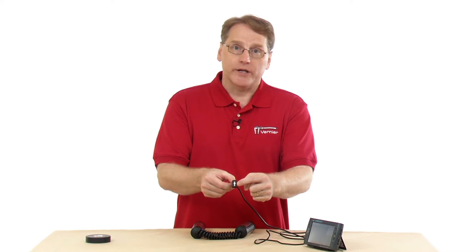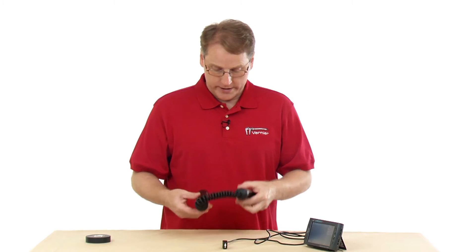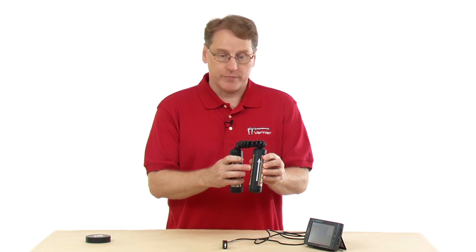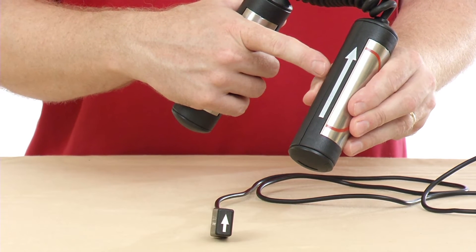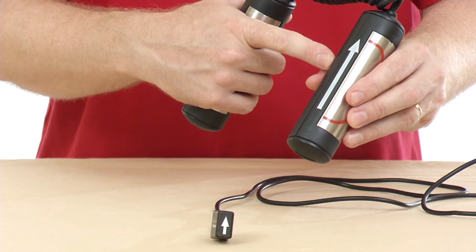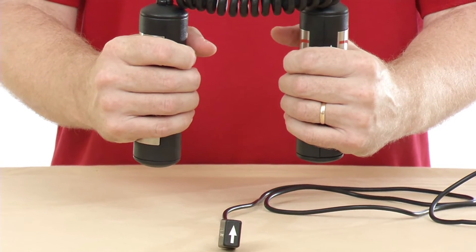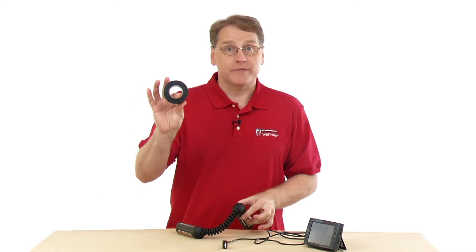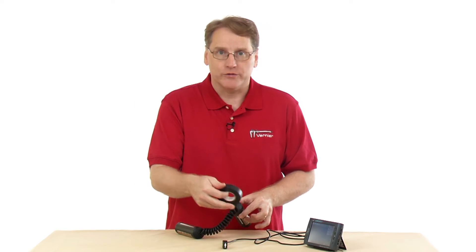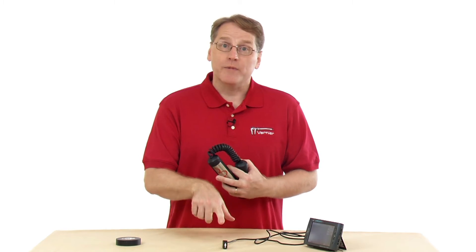A couple of issues to keep in mind. You'll notice there is an arrow on the receiver — we suggest you try to have this arrow in the same orientation as the arrow on the hand grip piece. By holding it in the same orientation, you're more likely to get good data. We also suggest that you hold the hand grip unit no more than about 80 centimeters from the receiver.